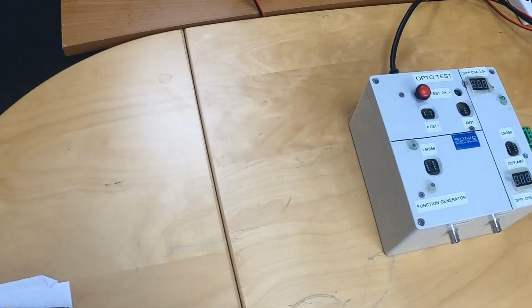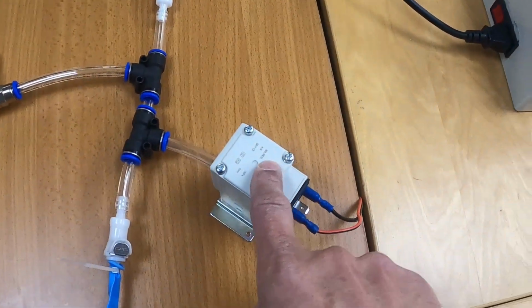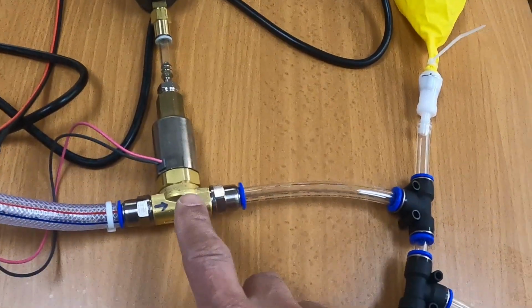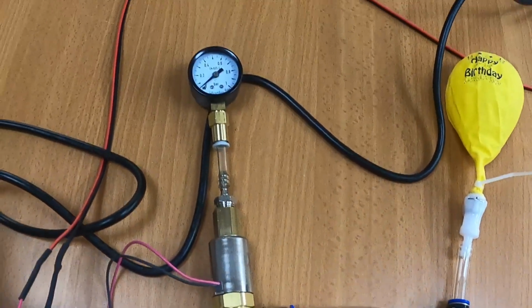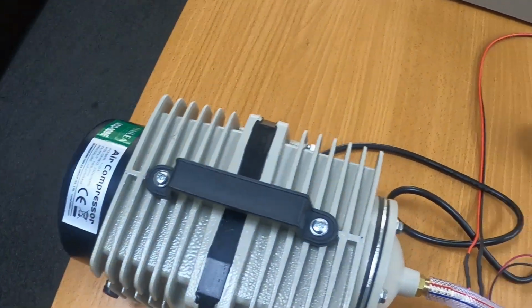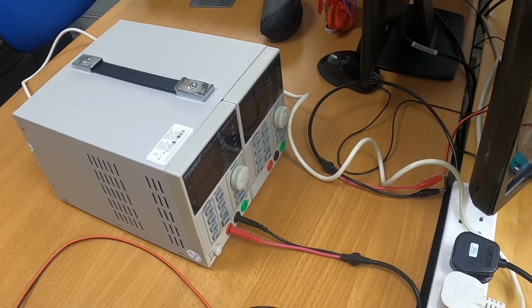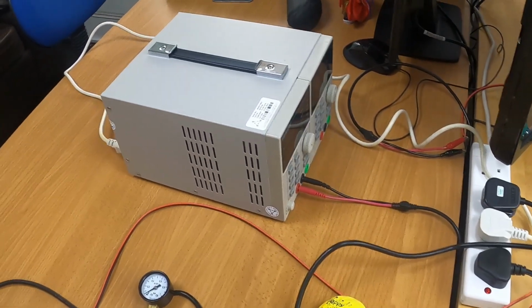So if we go this way, exhalation solenoid, our makeshift lungs, our inhalation solenoid, little gauge, our pump, and our 24 volt power supply, bench power supply. So let's see if this thing works.